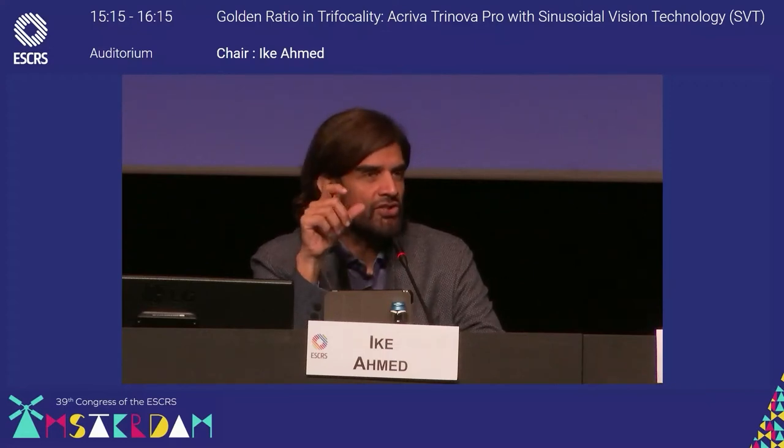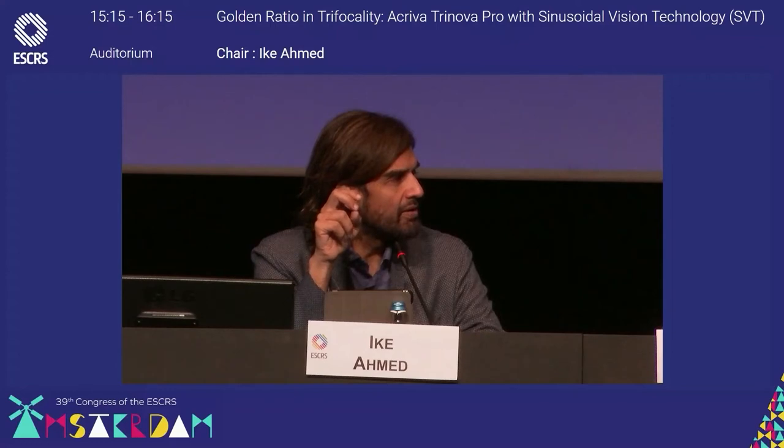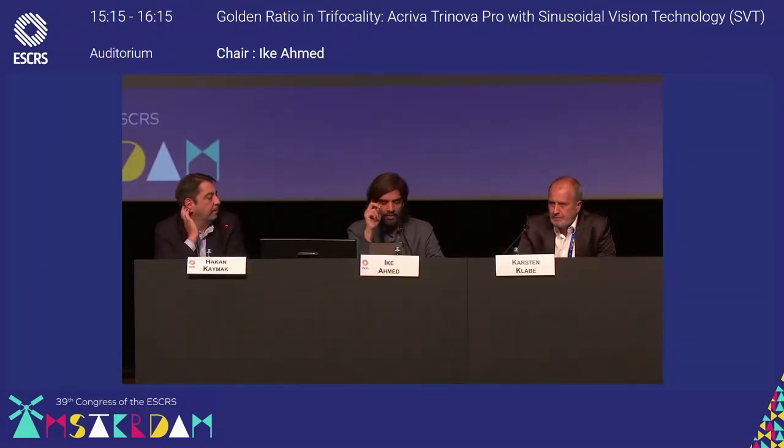Questions come up about incision size. Maybe you mentioned it, Karsten. What incision size are you using? Standard 2.2. Okay, good.